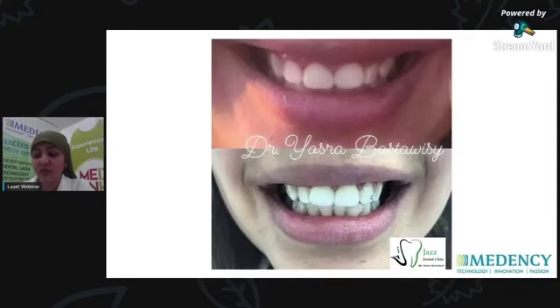Okay, this case, I'm so sorry about the before picture. I took it from the patient. Actually, I forgot to take a pre-operative picture of her at my dental clinic. For this patient I did gingivectomy and bleaching, as you can see in the after photo. And by the way, I did both of them at the same visit. I did gingivectomy and then bleaching at the same visit, and she was very happy and satisfied.